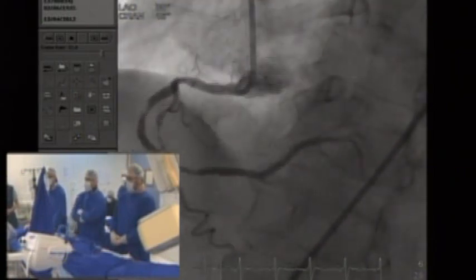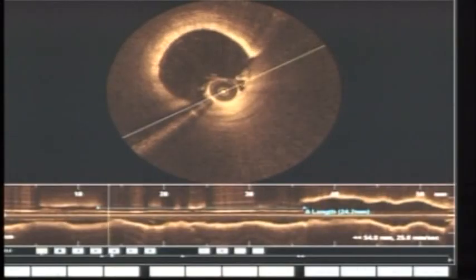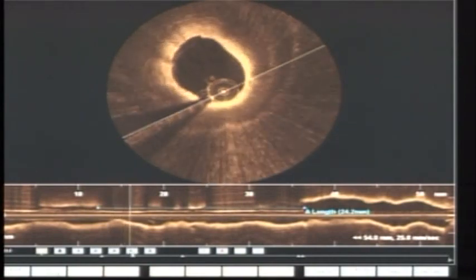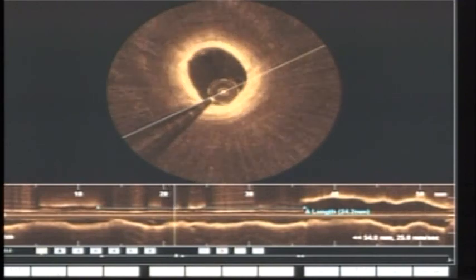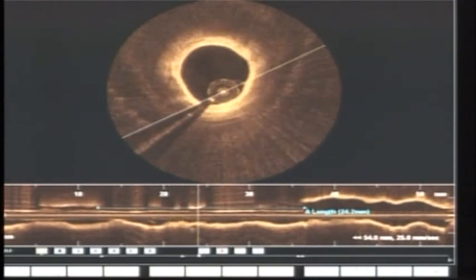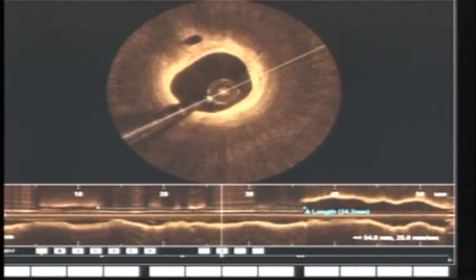So this view is the aerial view of the right, because we want to assess the lesion from both views. So, oh, this is the OCT already. Okay. Oh, I understand. Actually, we'll see, because we were actually preparing for OCT, we didn't take that shot.